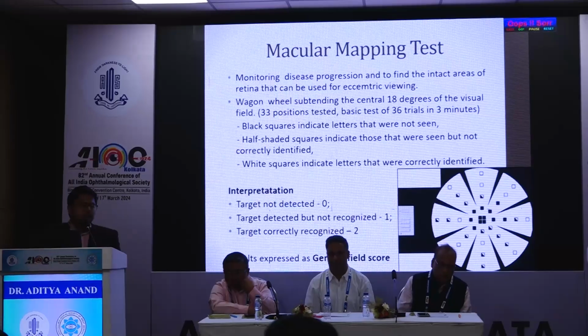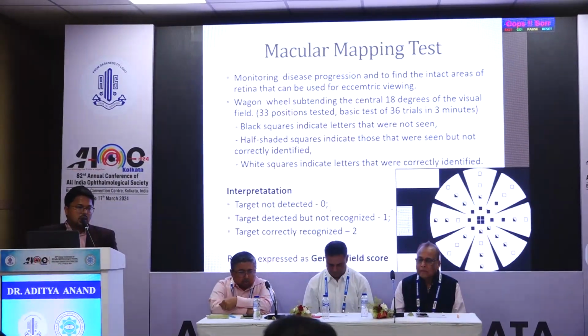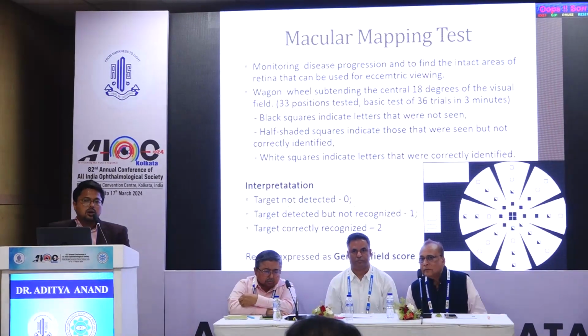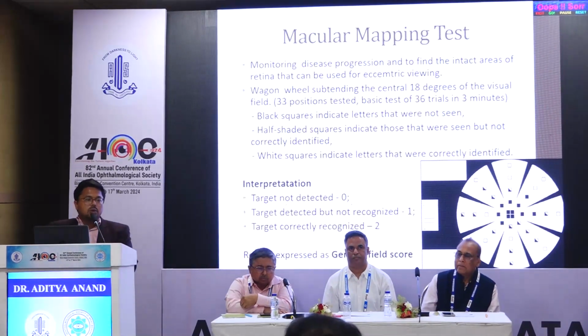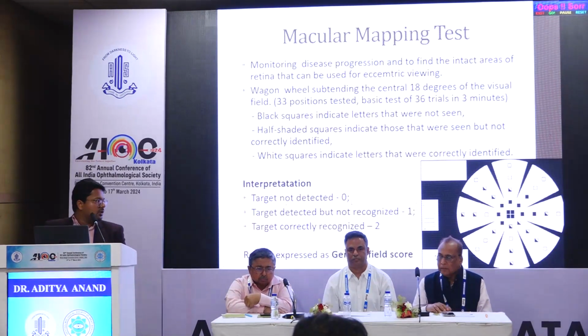Yes, sir. So basically, we generally perform ERG or VEP tests, or in a very semi-opaque media, we use a Maddox rod test. The first test that you said, the Maddox rod test, is more practical. But it can't always be used. In a very severe dense cataract or dense posterior segment pathology, we can't use that. But in a semi-opaque media, we can definitely go ahead with that.